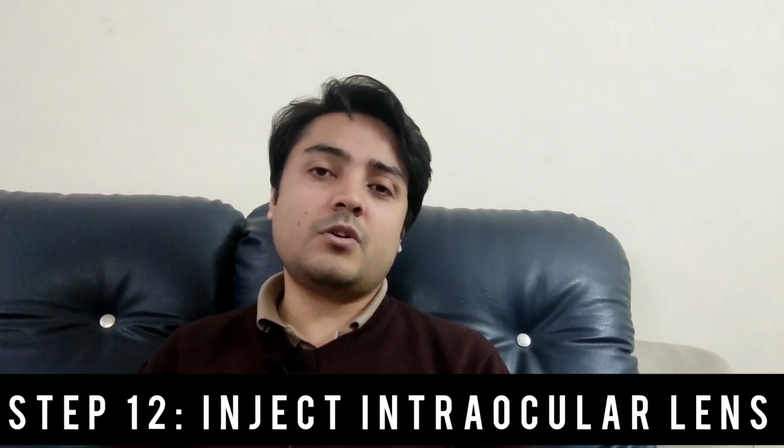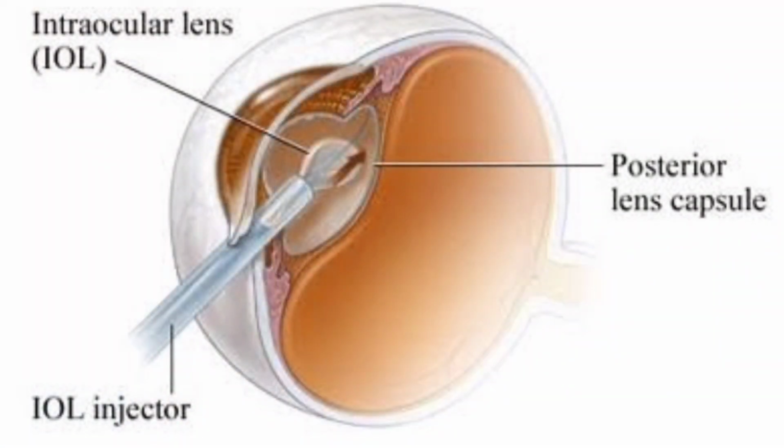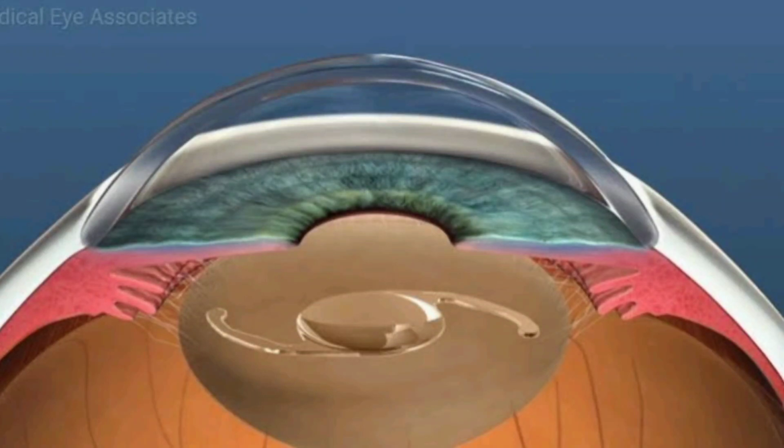Now this intraocular lens is a foldable lens. It can be folded and kept in an instrument, and this instrument is introduced through the same incision where we introduced our previous instruments, and once it is introduced it is injected in the capsule bag that is already left in place. Remember, we do not remove the capsule bag because if the capsule bag is removed, the lens will float freely in the posterior segment of the eye. So the capsule bag is kept in place, but the lens matter, the cataract matter, is removed.